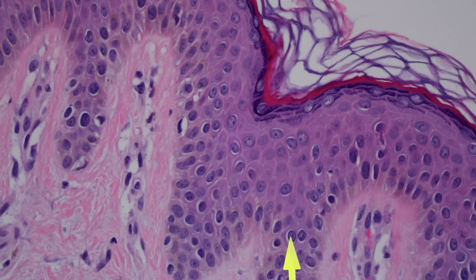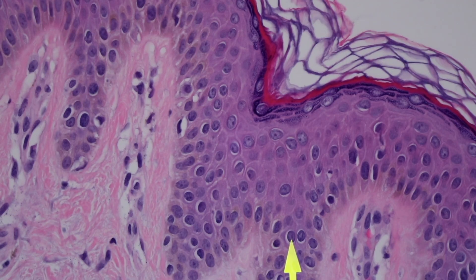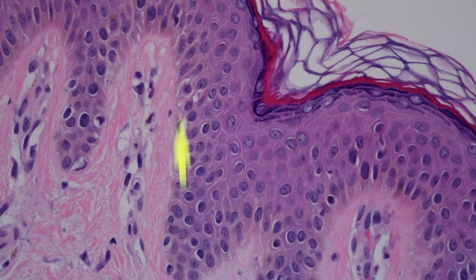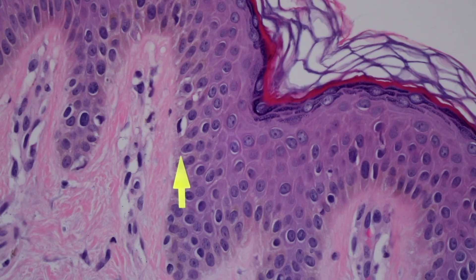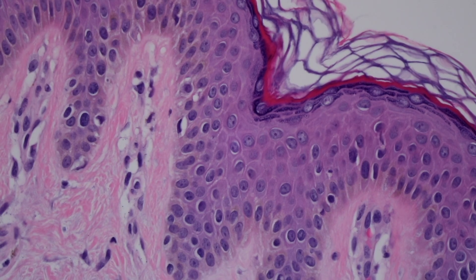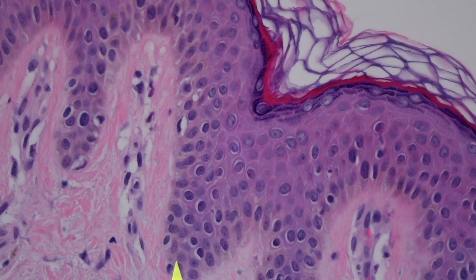So when you see vacuoles in the epidermis and you're trying to decide if it's a keratinocyte or a melanocyte: if they have the little halo right around the nucleus, it's probably a keratinocyte. If the nucleus has a little blob of spidery cytoplasm around it, it's probably a melanocyte. So these two cells here are melanocytes, and normal melanocytes live along the basal layer.